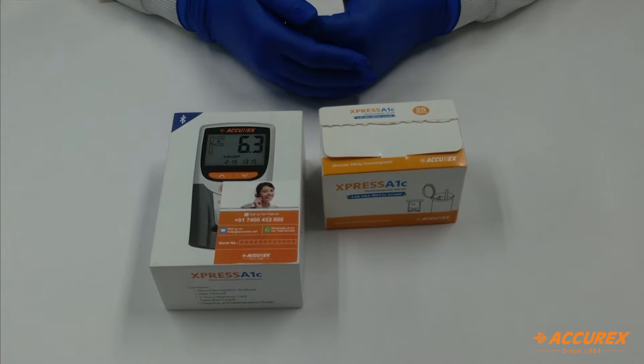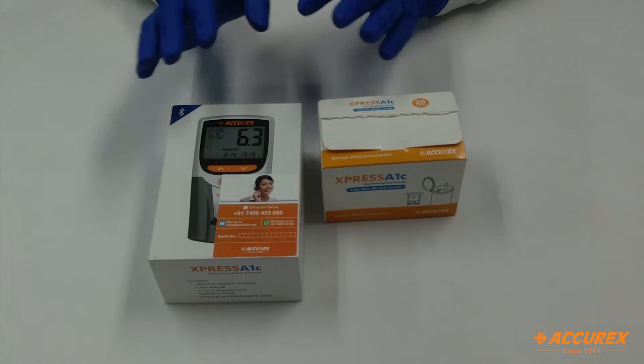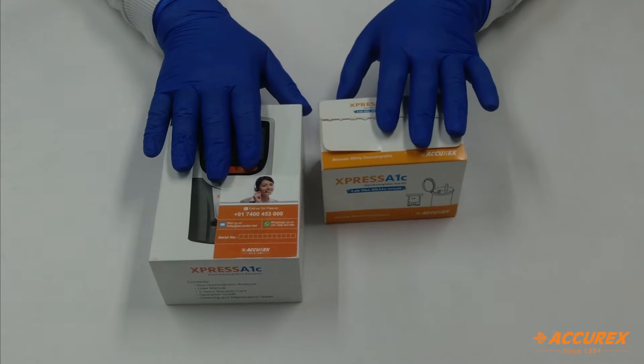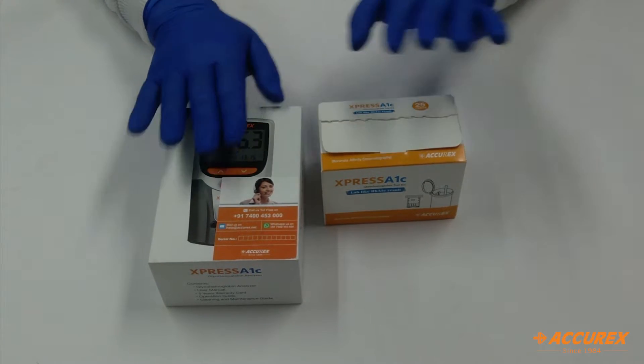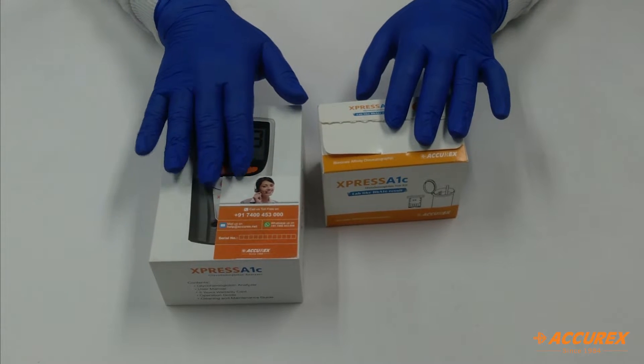Hello friends, welcome to Aquilex YouTube channel. Today we will see about the Express A1C analyzer. Here you can see there are two kits — one is the meter and the second is the strips. We will see one by one what are the contents inside these kits.